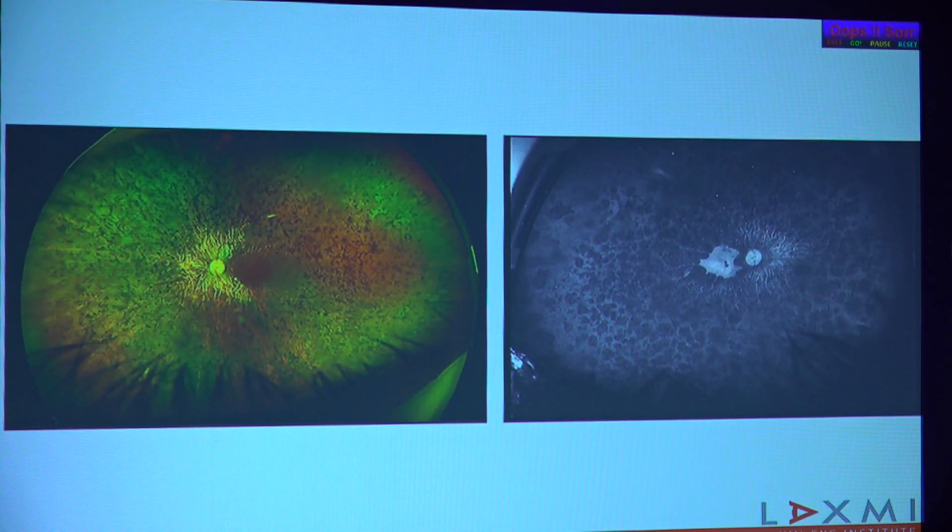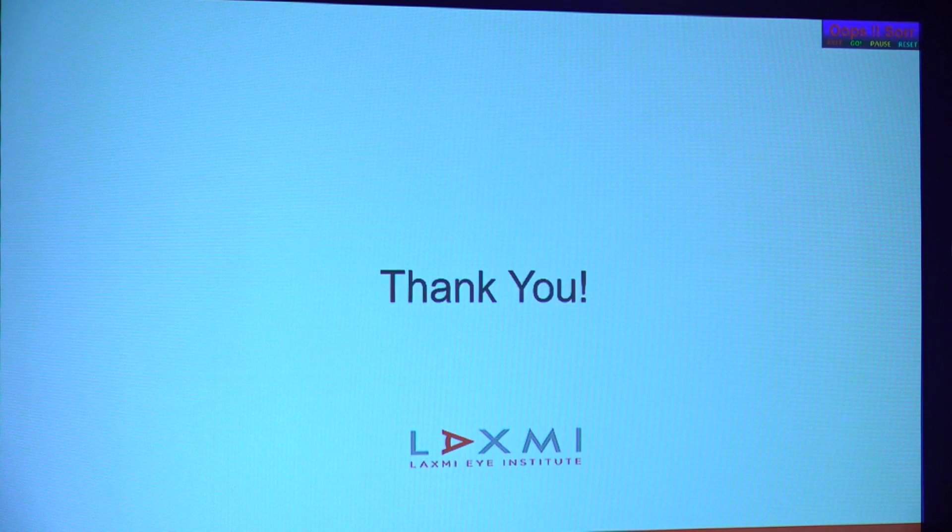The last slide is a patient with retinitis pigmentosa. There are multiple forms of autofluorescence described in RP, but this is probably closest to our understanding — there is sparing of the macula with total loss or abnormal autofluorescence in the periphery, and this is probably the only functional retinal tissue currently present in the eye. With that, I will conclude my talk, and of course we can have discussion later.